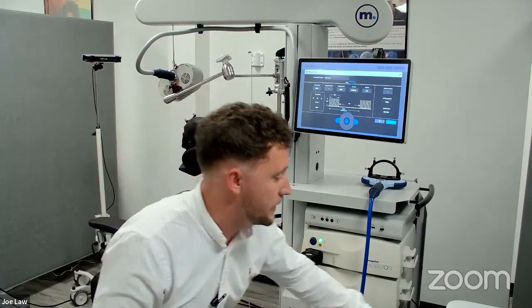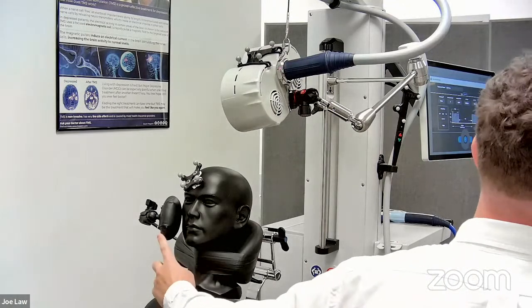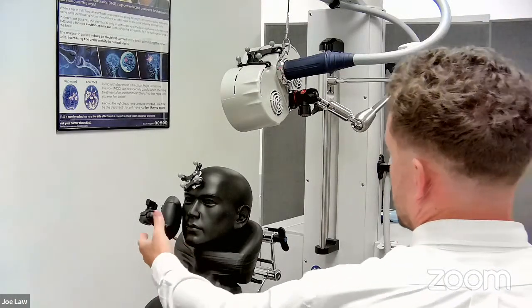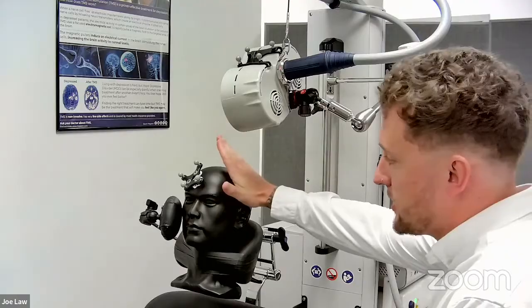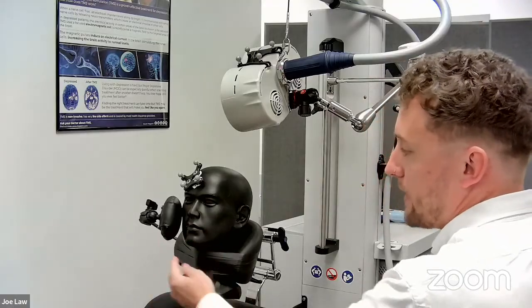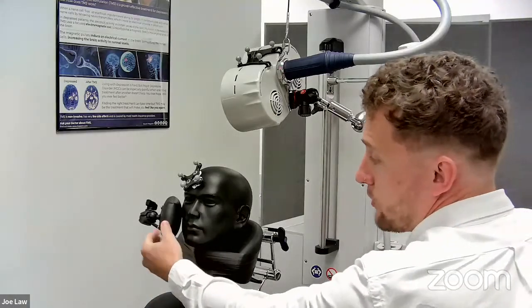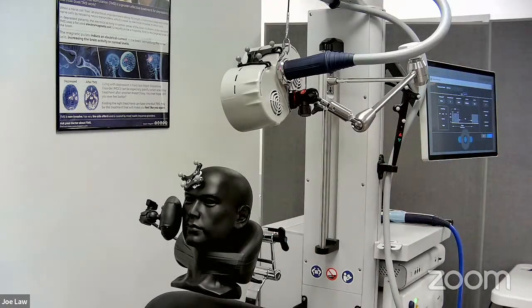It also comes with, if I switch cameras, you can see here, a cheek rest. The way this works is you gently place this against the patient's head. So when you put the coil on the patient's head here, it stops the patient from shying away and moving their head to the right-hand side. So you can use that as a cheek rest or a temple rest. Again, fully adjustable on 3 ball joints.